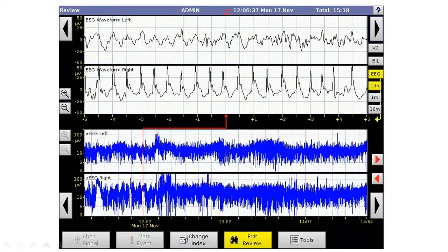They become very clear to see as time evolves. And then of course, opening up one of these uprisings and validating whether or not we see a spike and a wave and a rhythmic behavior of the EEG lasting for more than 10 seconds. But the intermittent uprisings here are the things that really clue us into there being an issue with the brain, not necessarily with the background activity. The background looks pretty good, but there are definitely these uprisings which give us a clue towards brain dysfunction.